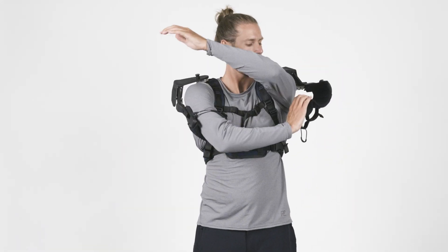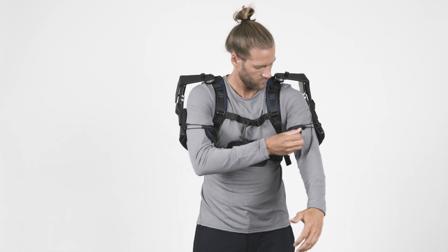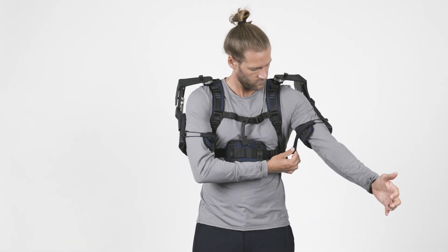Repeat the same steps for the other arm: unlock the joint, pull the cuff down, insert your arm, close it, and tighten it if necessary.